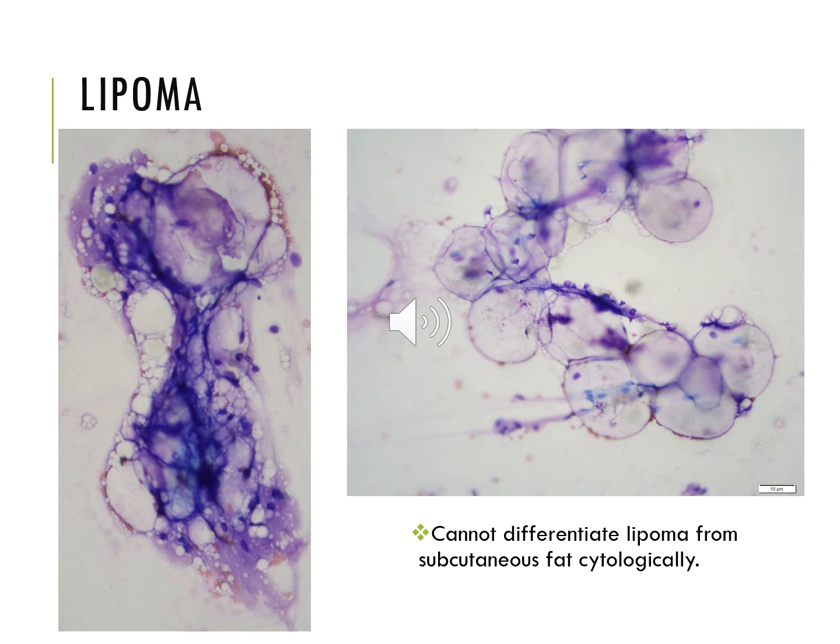However, if the mass did not seem like a lipoma to them, if it was much more firm, adhered to underlying musculature or bone or something, then they may have just missed the target, and they may have just aspirated the adjacent subcutaneous fat, which happens. It's not a big deal, and I always offer resubmit for these, but I just wanted to point out that we on cytology cannot differentiate a lipoma from subcutaneous fat because, again, all you see is well-differentiated adipocytes with both of them.